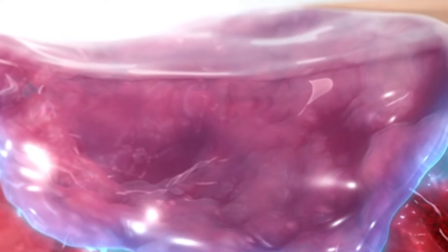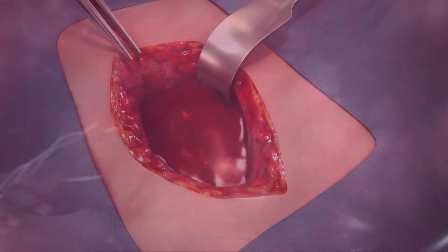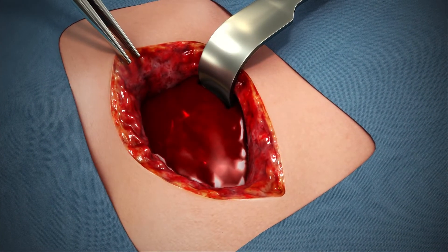AC5 Advanced Wound System simplifies the complexity of managing challenging wounds and may reduce patient at-home wound care burden.